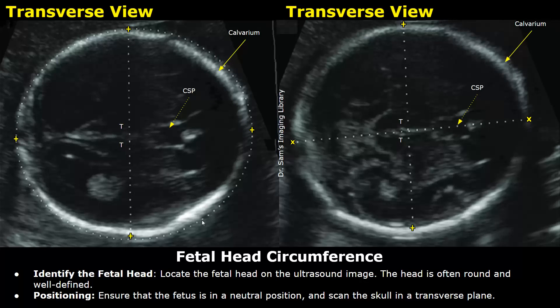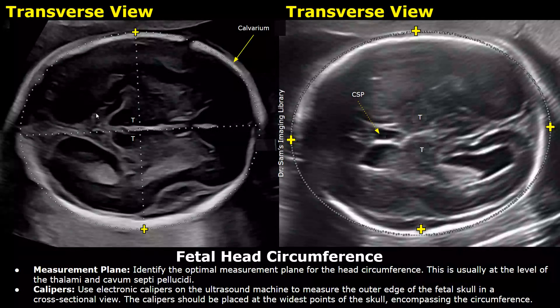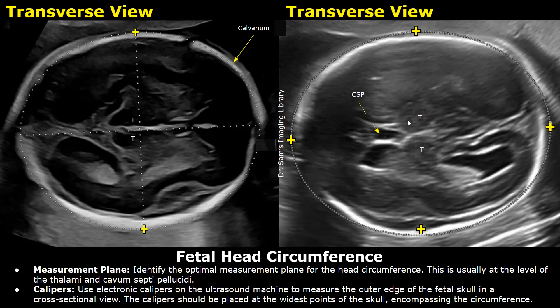This is the fetal brain. The optimal measurement plane for the head circumference is the level of the thalami and the cavum septum pellucidum. These hypoechoic structures are the thalami, and this anechoic structure is the cavum septum pellucidum. This is a good level to take the measurement.